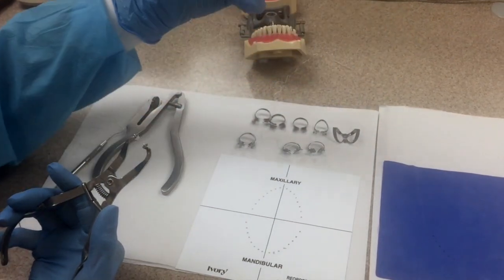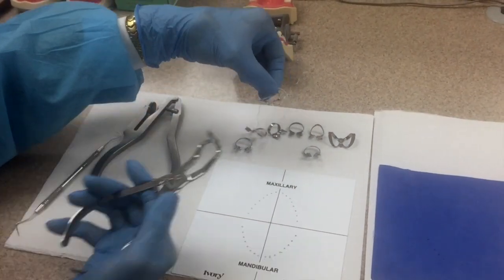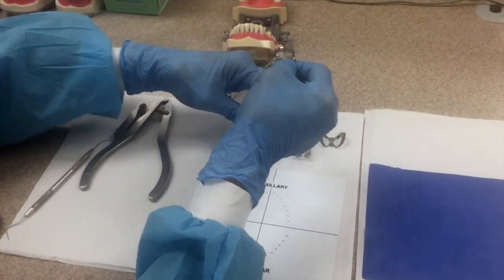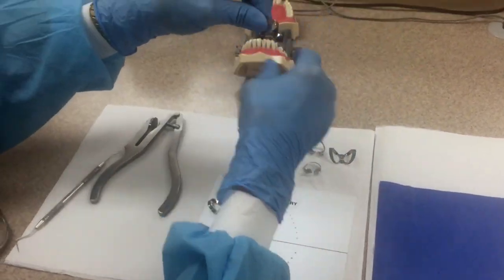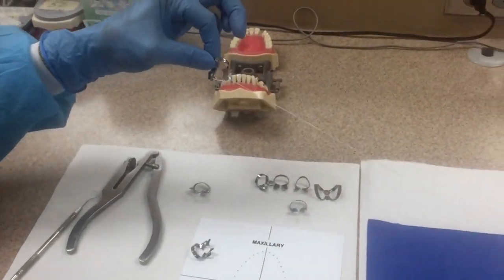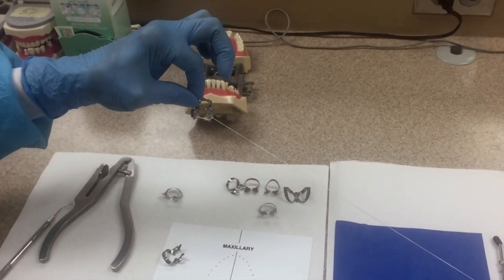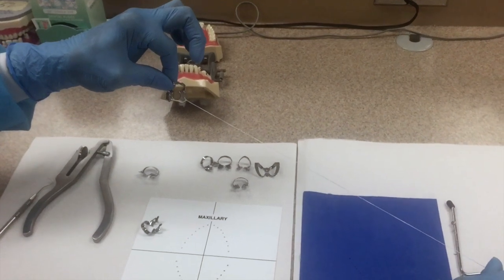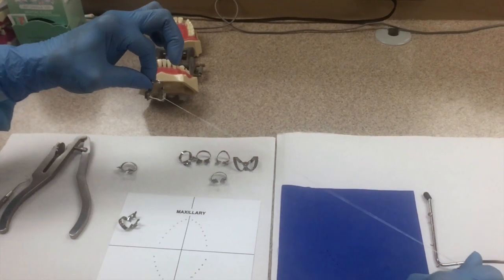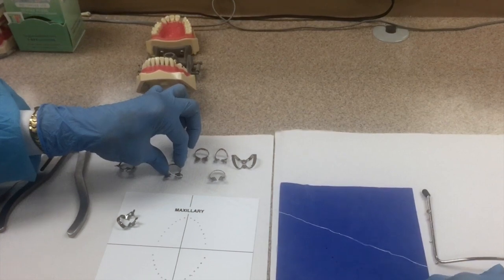It feels very tight. You can imagine if you don't have good anesthesia, these prongs could really hurt. I have attached a piece of dental floss to this retainer and that's a fail-safe mechanism. If the patient should swallow or aspirate this clamp, we have some means of retrieving it. That rarely happens.